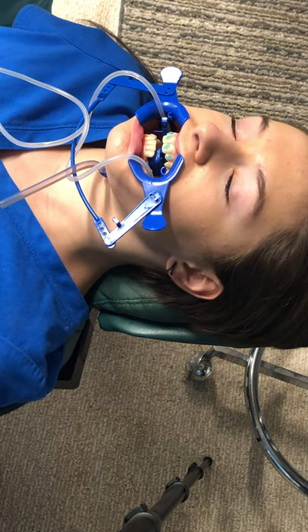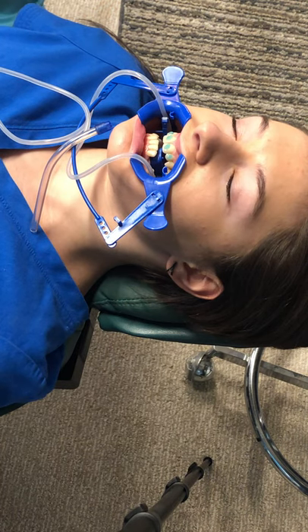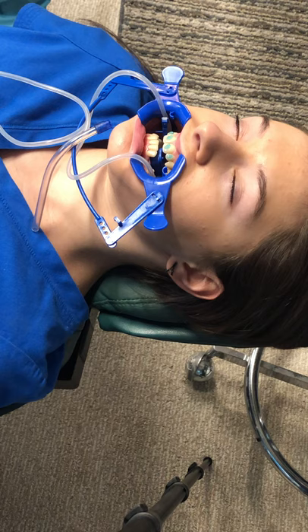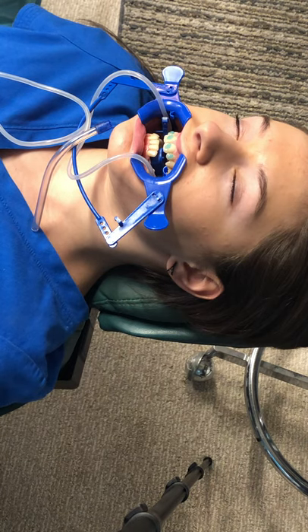How long do we leave that on there? It's 30 seconds. You always want to make sure that you ask if there's a new etch or something — read the manufacturer's instructions, because some might say 45 seconds. For this one, it's 30 seconds.